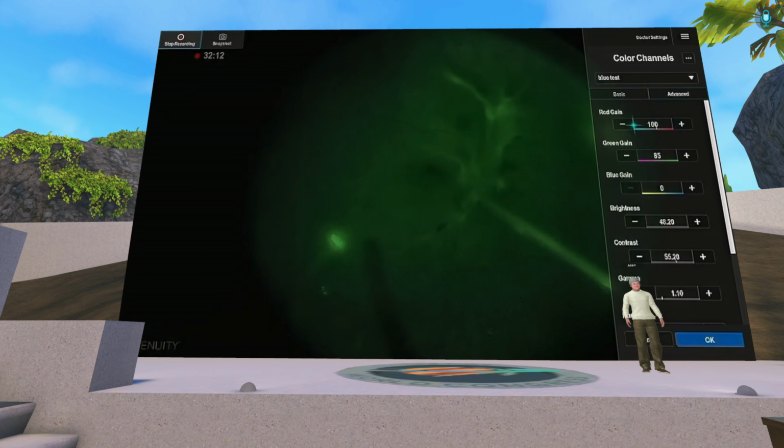On the Constellation, I must add that a new light bulb is quite a bit better than a used one, meaning that if you have above 350 hours of usage, it will still work, but the intensity of the light wouldn't be like a new lamp. In the intraop FFA, for me, it makes a difference. So check the hours of your light bulbs. They are easily seen in the menu, and if you want better contrast, you might need to invest in a new light bulb.